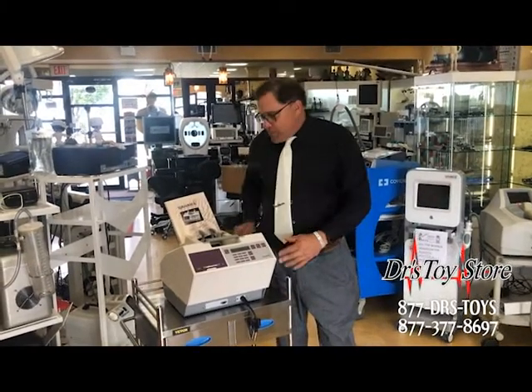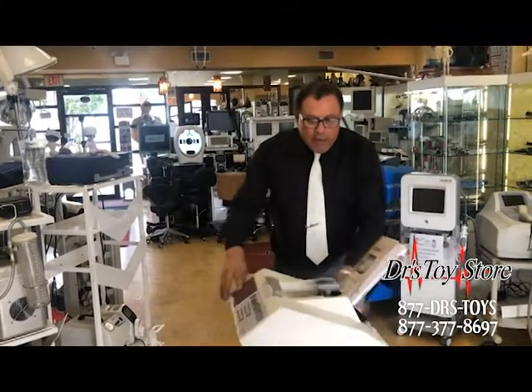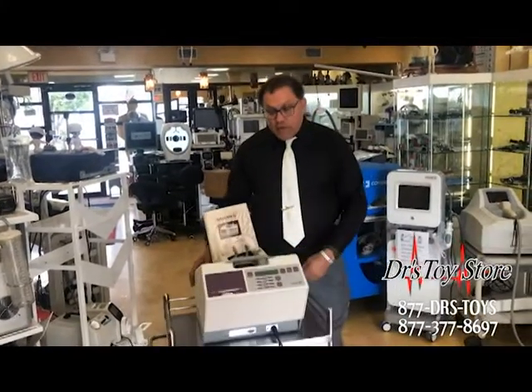This is a great little system. It's portable, it's small. It's got all the paper, the manual, and it's never been used. It's got the Phantom.